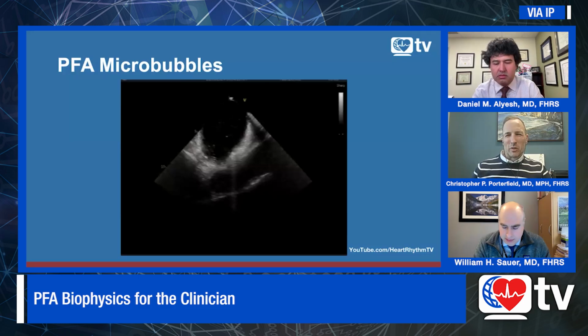For these cerebral events are very worrisome to me, and if it's truly related to the microbubbles or if it's coagulum, that's I think to be determined. I know in ADVENT and PULSED AF, they showed all of these cerebral lesions on MRI, but they didn't do MRI on all the patients. And so we haven't really looked as deep as probably we should and need to look in this technology to see what's going on cerebrally. I am worried about that.